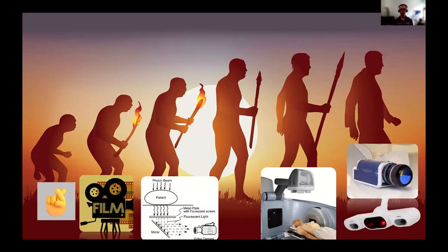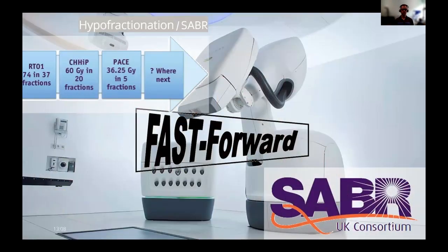This cone beam imaging let us bring those dose conformity gains down with the VMAT. And I would say that SGRT, and then Mike's going to talk about the DoseRT, which the blue camera there is, this is as big a step change as cone beam. I really do feel that.